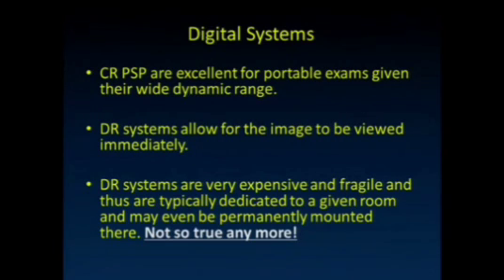DR systems, well, cesium iodide, that's a very delicate crystal, but now if you go to some of these photoconductor materials like amorphous selenium, they're not as delicate, and so you can make a portable plate. And now with wireless technology, you can make a digital plate, right, take it up to the ICU, and once it's exposed, have that data be transmitted from the plate itself wirelessly to the network in the hospital, so you can have it in your reading room before the tech basically even leaves the patient's room. And that's where we're starting to be, and definitely where we're going to be a few years down the road. Okay, so this is not so true anymore.